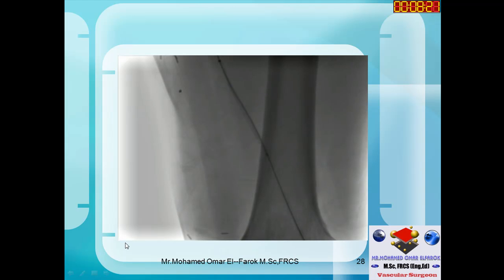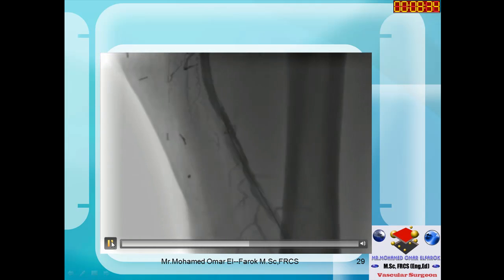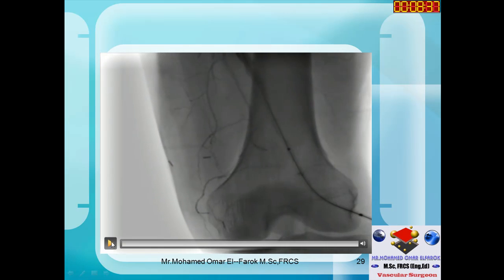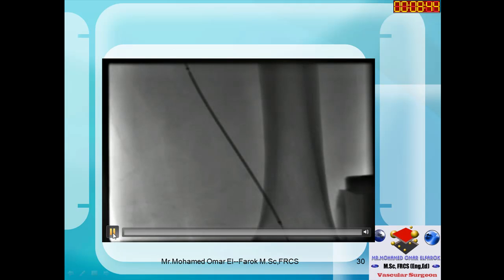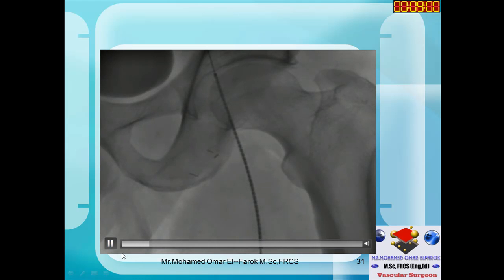Another balloon dilatation was performed at the re-entry point to secure it and ensure good flow to the popliteal artery. A stent was then placed at the upper end. You can see flow in the superficial femoral artery, the re-entry section, and flow returning to the popliteal artery. A precise control 7 mm by 80 mm self-expandable nitinol stent was deployed at the lower end to secure it, followed by another nitinol self-expandable precise control 7 mm by 80 mm stent at the upper end, which you can see being gradually deployed.